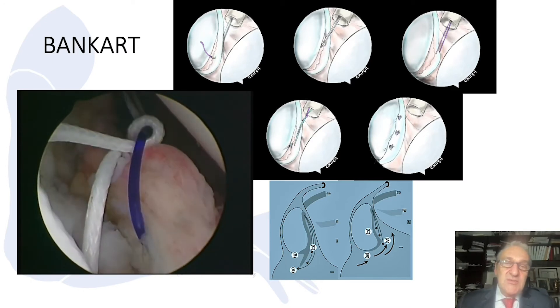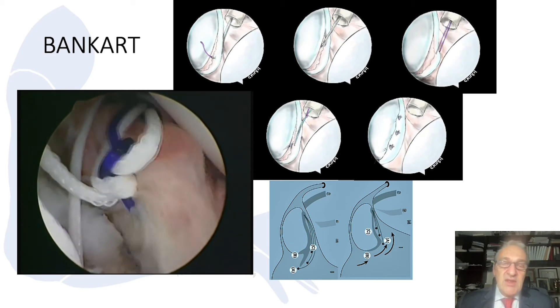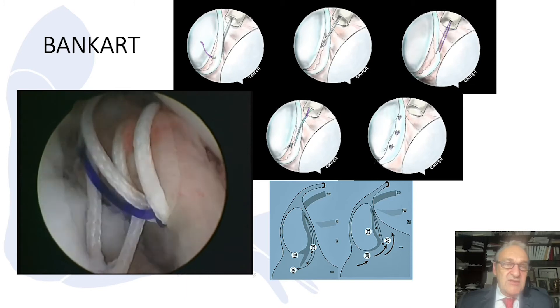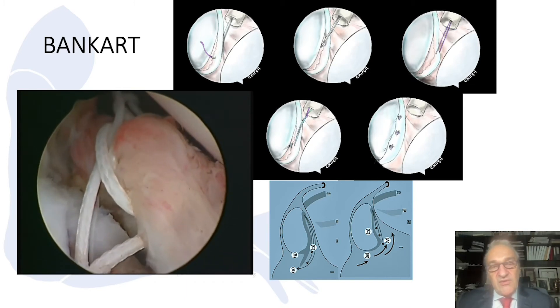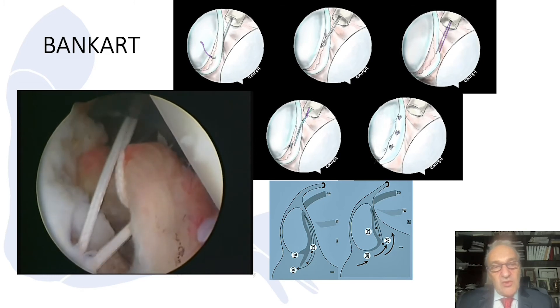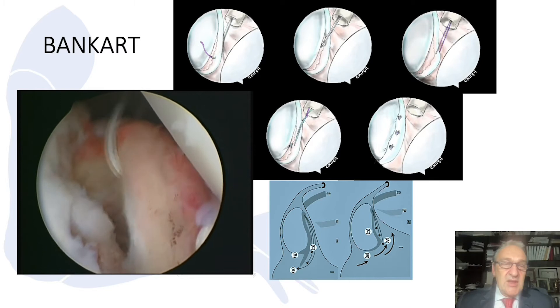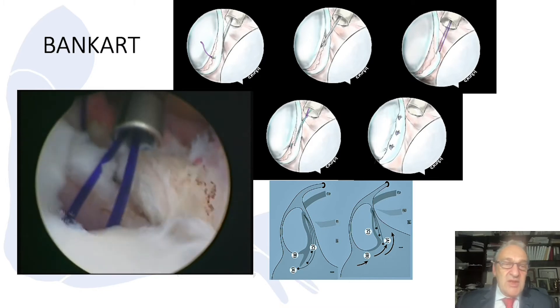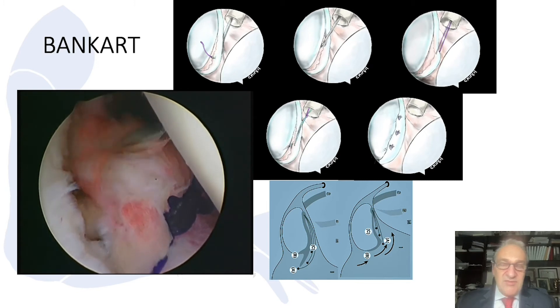With the traction suture, we make the advancement early. Then we place the first anchor, and generally we use three anchors total. Starting from the 5 o'clock position to the 3 o'clock position, these three anchors provide good stability and a stable labral fixation.